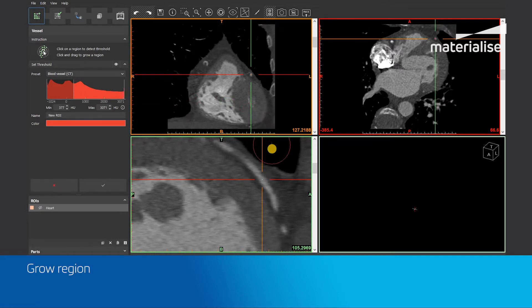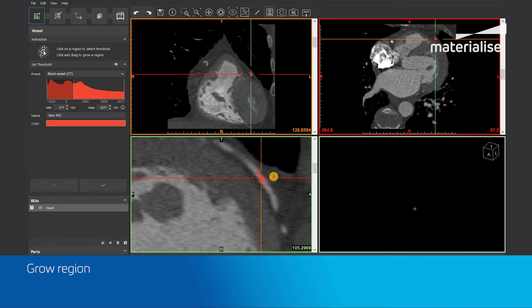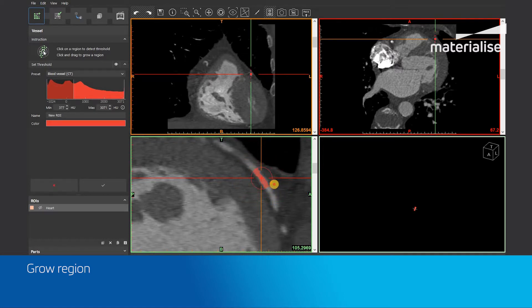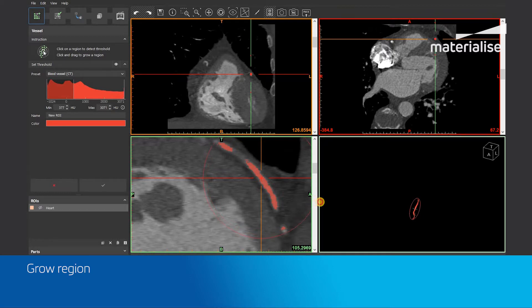After defining the proper threshold range, we can start growing to segment the vessel. To grow, left-click and drag your mouse to increase the size of the grow. The dot on the circle shows where your mouse is so that you can easily decrease the size of your grow. You will now immediately see the result of the grow operation in the images and in the 3D preview. All the pixels that are part of the defined threshold range, connected to each other and inside the sphere, will be segmented.